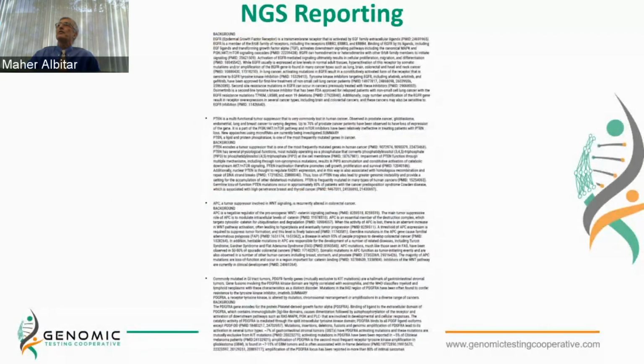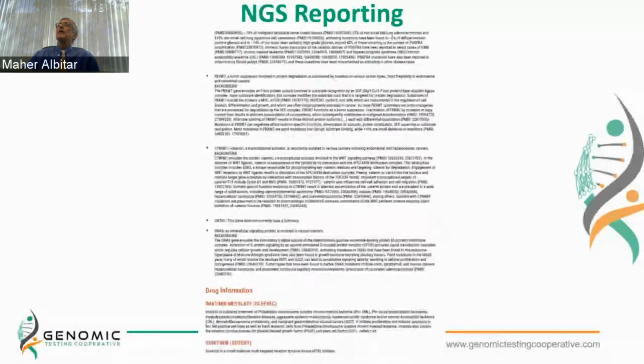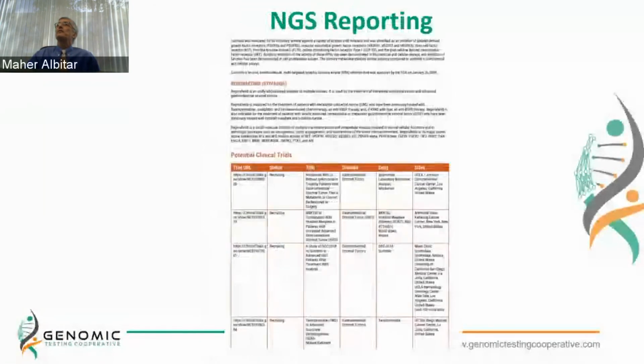And next slide after. So this is an actual patient example report. Next slide. The related drug information will be listed. If there are clinical trials, these clinical trials will be listed as well. Next slide.